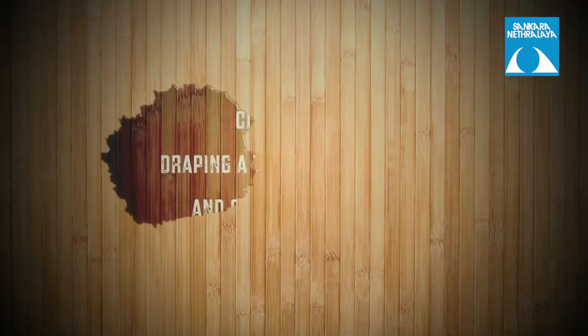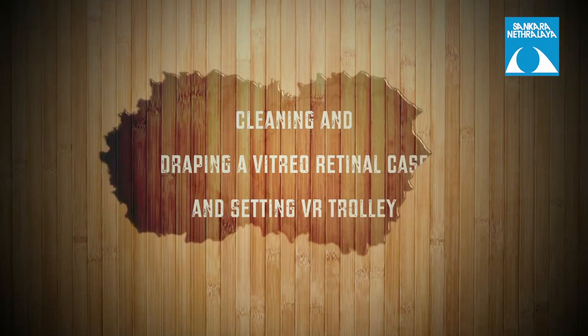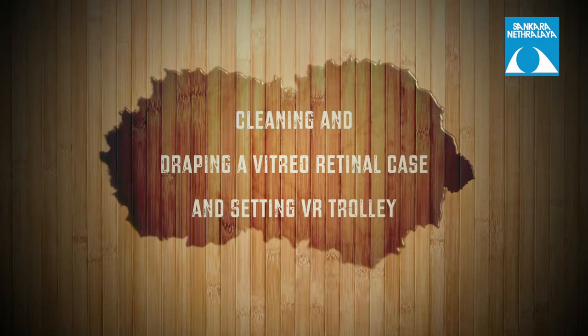Hello everyone. In this video we will see the method of cleaning and draping a case for vitreo-retina surgery and setting up of a VR trolley.